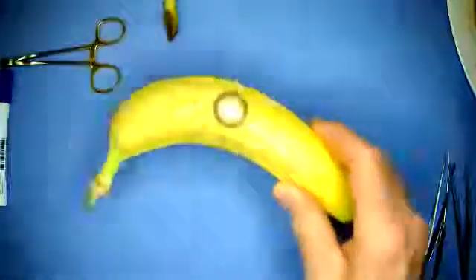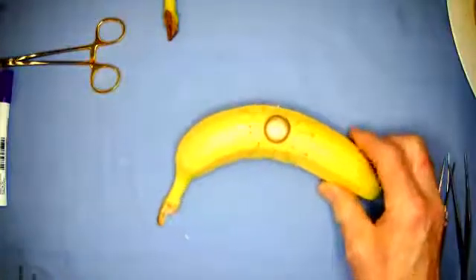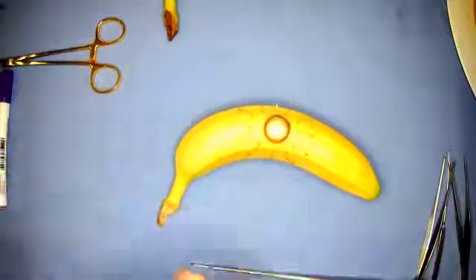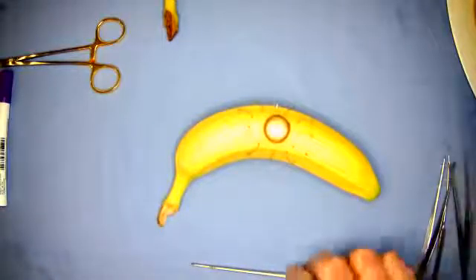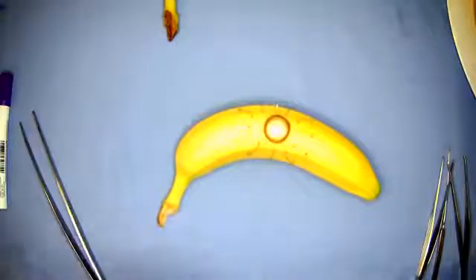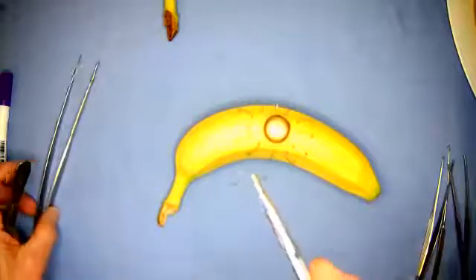We've done stitching in our previous episodes. The thing is that I've asked you to stitch with your non-dominant hand behind your back. The reason for that is because I wanted you to concentrate on the rotation and placement of the needle. But of course, we don't operate one-handed, do we?